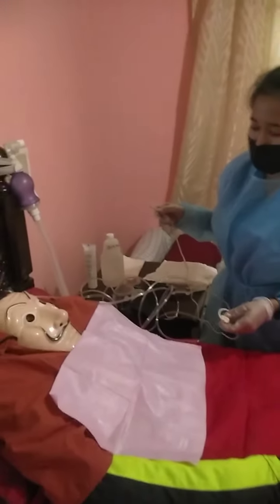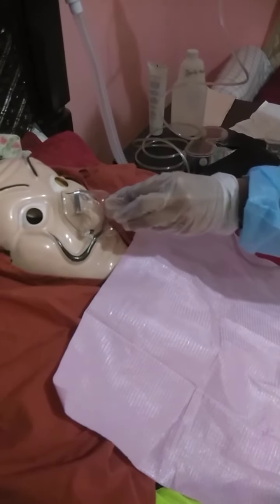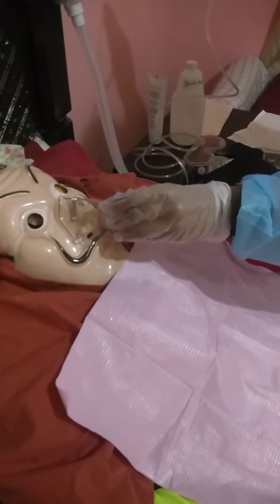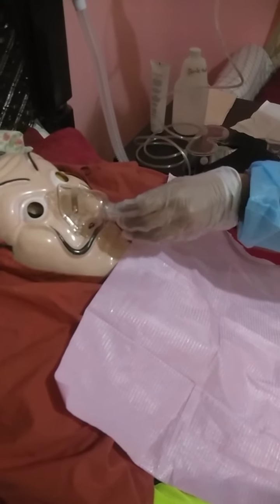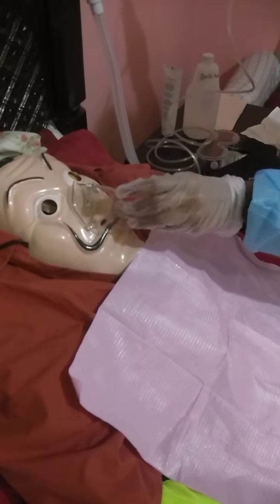Ma'am, can you cough for me? Replace her oxygen device and instruct her to inhale deeply. Assess whether to repeat the suctioning procedure. Rinse the catheter, then the connecting tubing, by suctioning normal saline through the catheter until you have cleared the secretions.